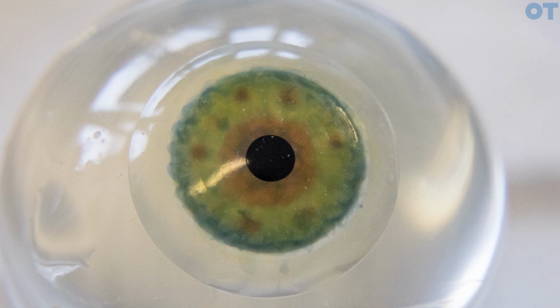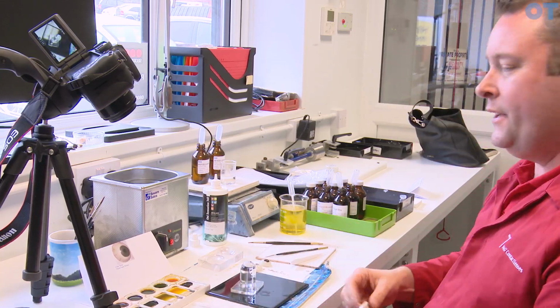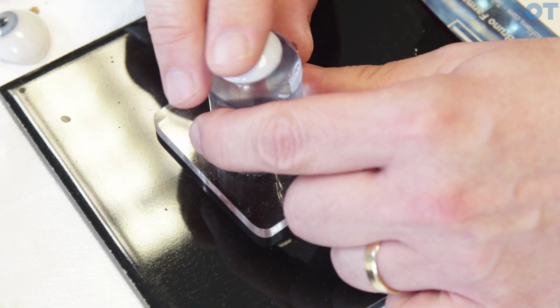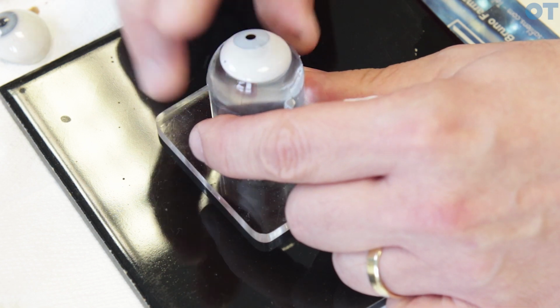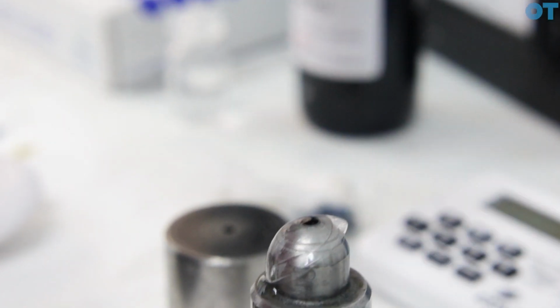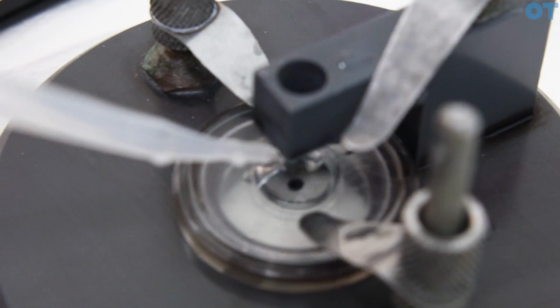So the next one I can do the Strabismus one now. Yeah, so what I'm doing now is painting a Strabismus lens, which is more extensive than just painting the iris, because I'm painting the scleral part as well. There's a bit more going on with this lens. So the lens has been prepared, and opaqued entirely over the whole lens from edge to edge.